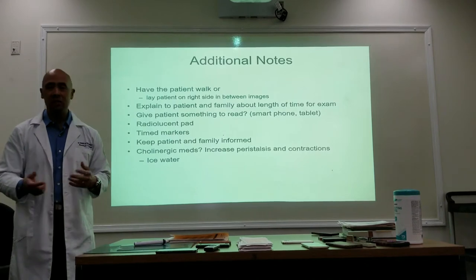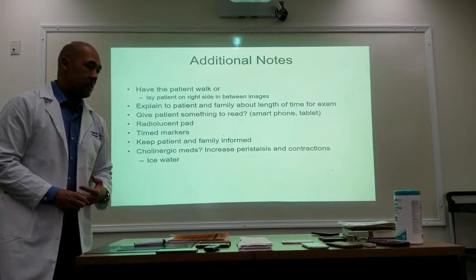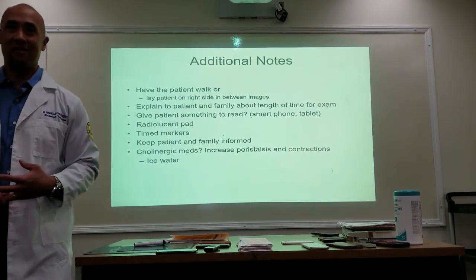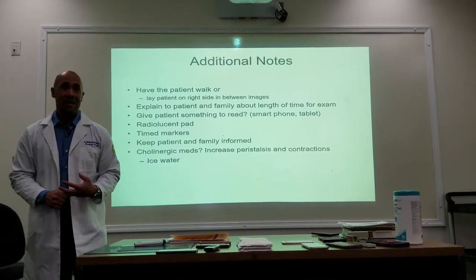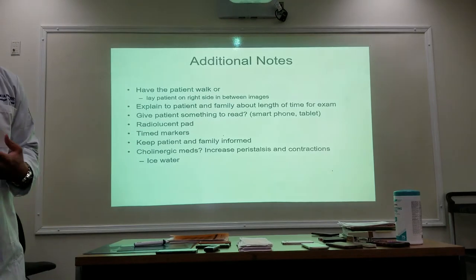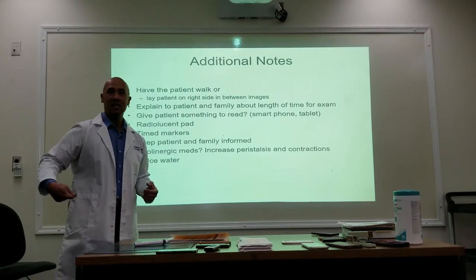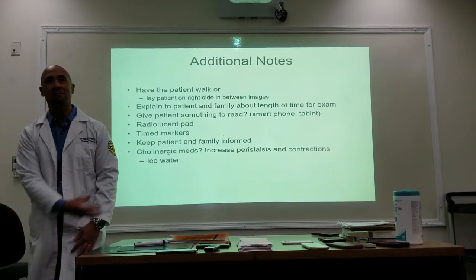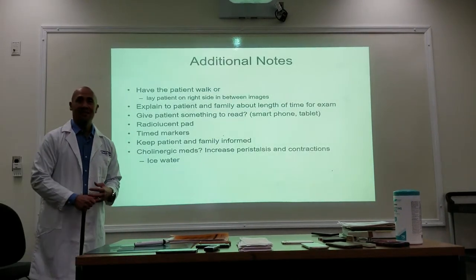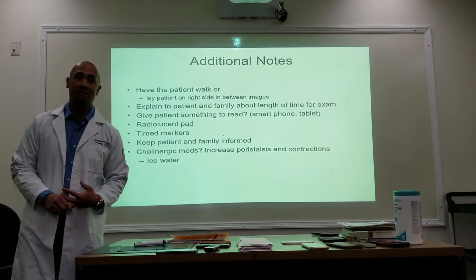So I'm going to share this with you now. We'll talk about it next week. Someone who has a bowel obstruction, lower bowel obstruction, the doctor may order an enema for therapeutic purposes. Not for diagnostic purposes, therapeutic purposes. So don't be surprised if you get somebody who has bowel obstruction, fecal impaction, lots of poop in there, and the doctor orders an iodine enema. Because once you get that iodine in their large bowel, they just flush right out. So be ready to wear a gown, shoe covers, gloves, a mask. They order those procedures for therapeutic reasons, not for diagnostic reasons. So iodine has the capability of doing that. Just wear a raincoat.